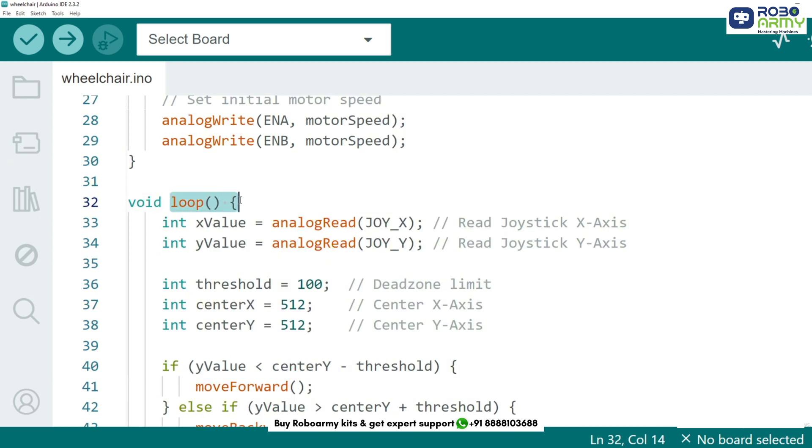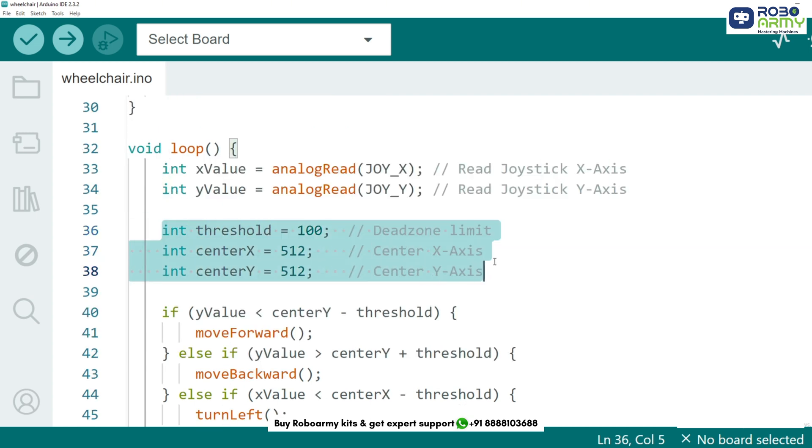In the loop function, we read the joystick values using analog read function. The joystick values range from 0 to 1023. If the joystick is near the center, we consider it has no movement using a threshold.